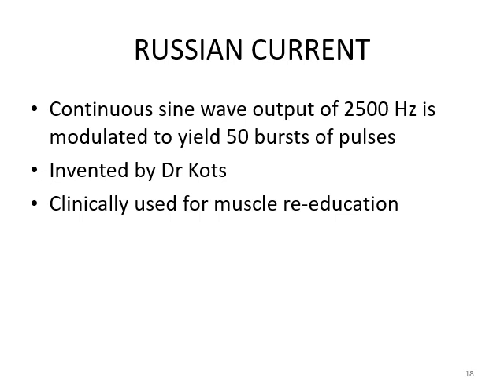These are continuous sine wave outputs of 2500 Hz, and they are modulated with on-off time in such a way that they give 50 bursts of pulses in a second.